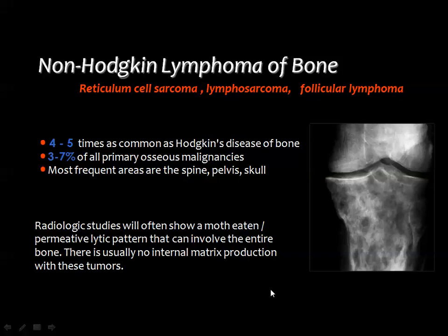In the absence of aggressive bone destructive changes, periosteal reaction, and the extraosseous soft tissue component, then you may think of bone lymphoma.